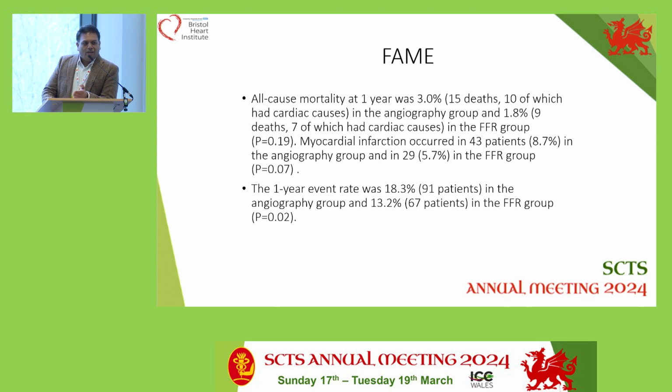benefit of FFR-guided PCI. Now, there are various ways to look at the data, and one of the interesting ways would be to say that the fewer stents that were put in, the more benefit the patients got. But in a general sense, it's reasonable to assume that if pressure wire-guided ischemia was demonstrated in a particular epicardial vessel, the patients benefited.